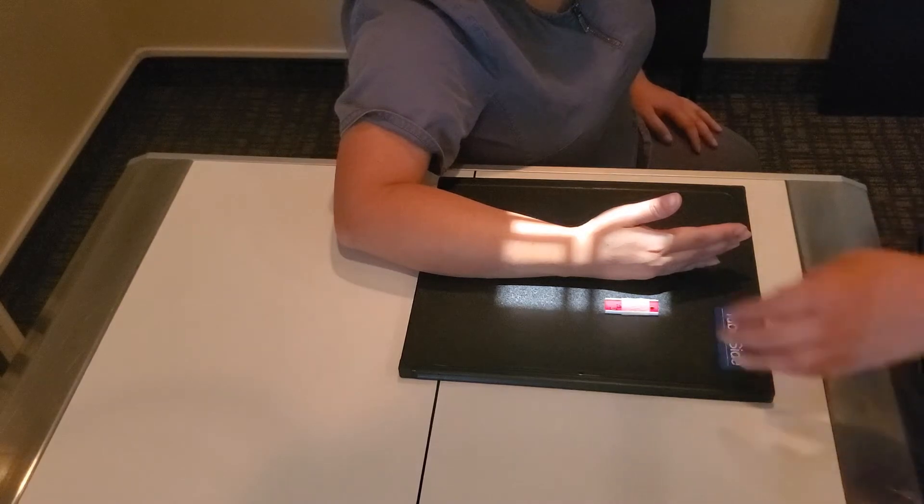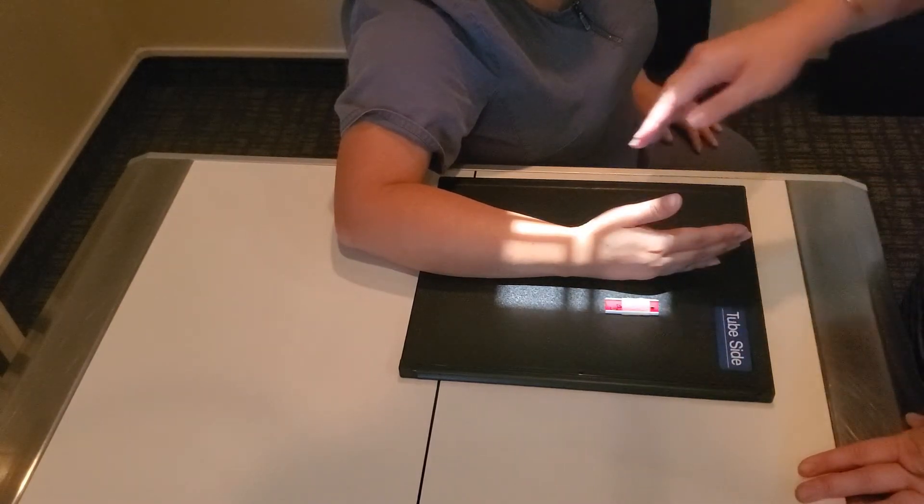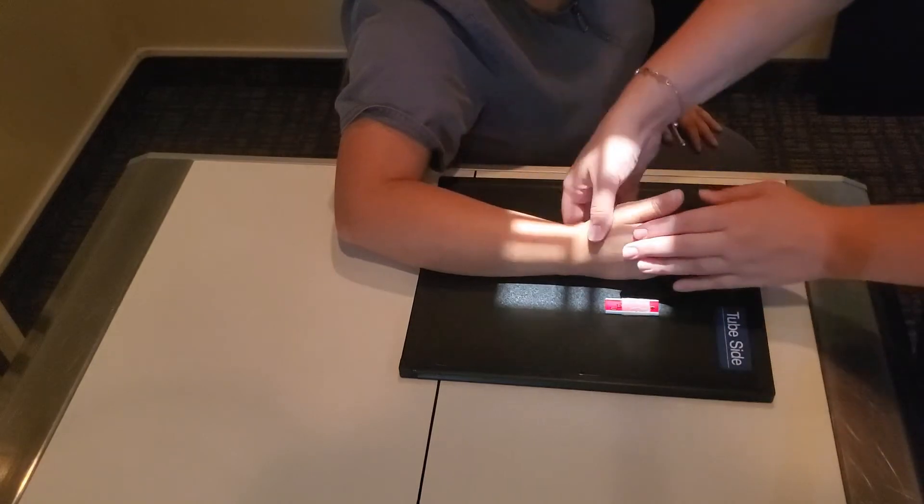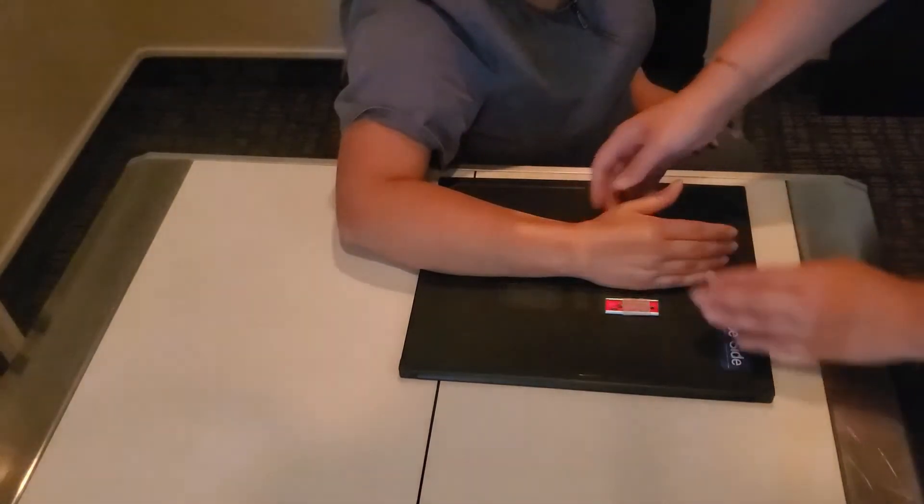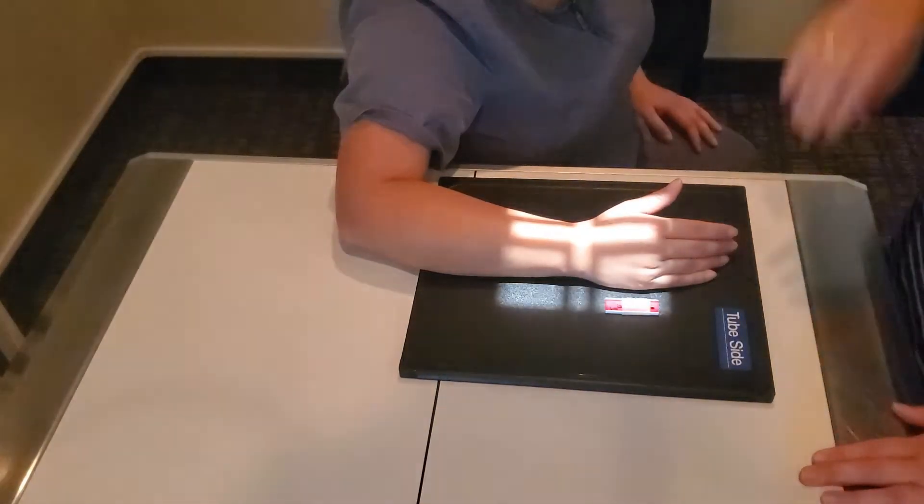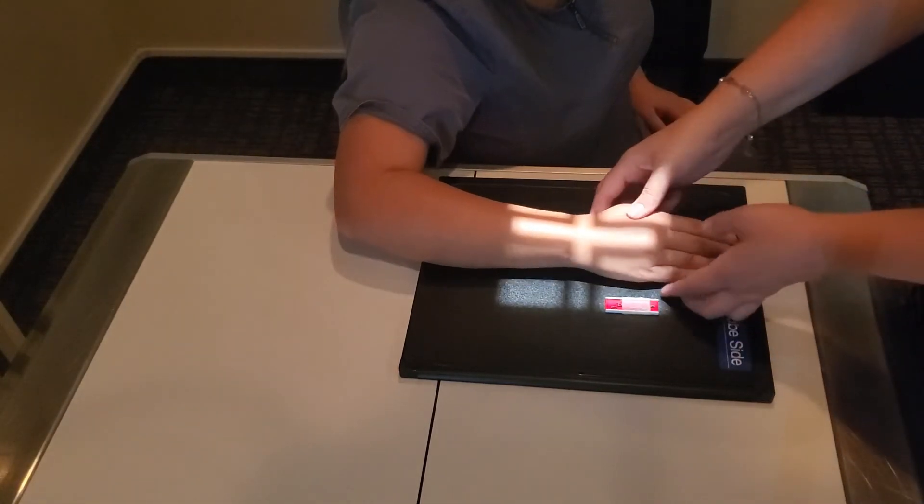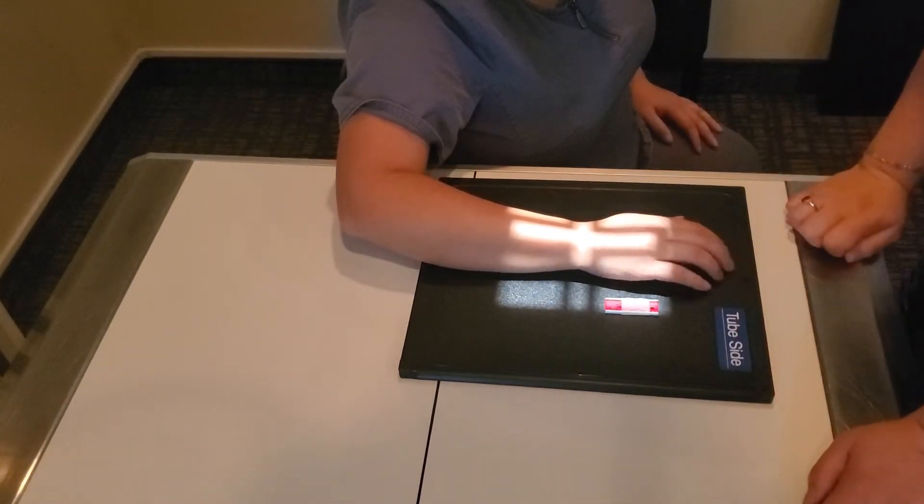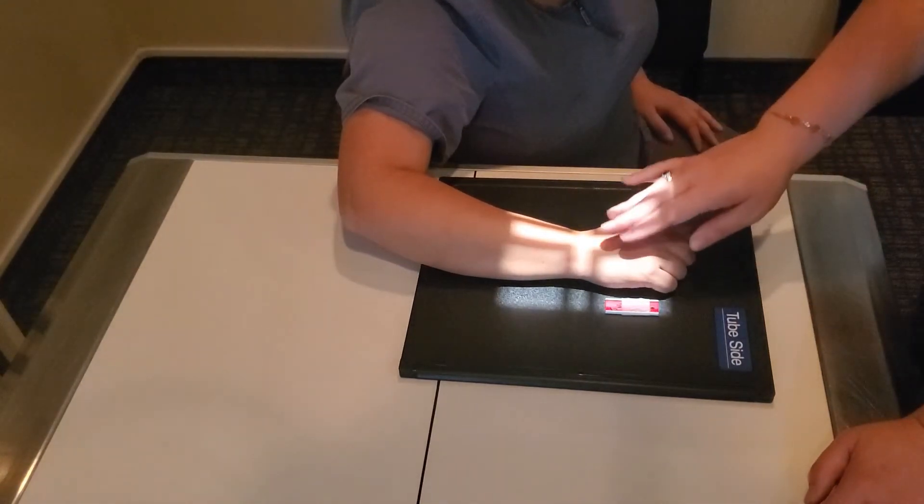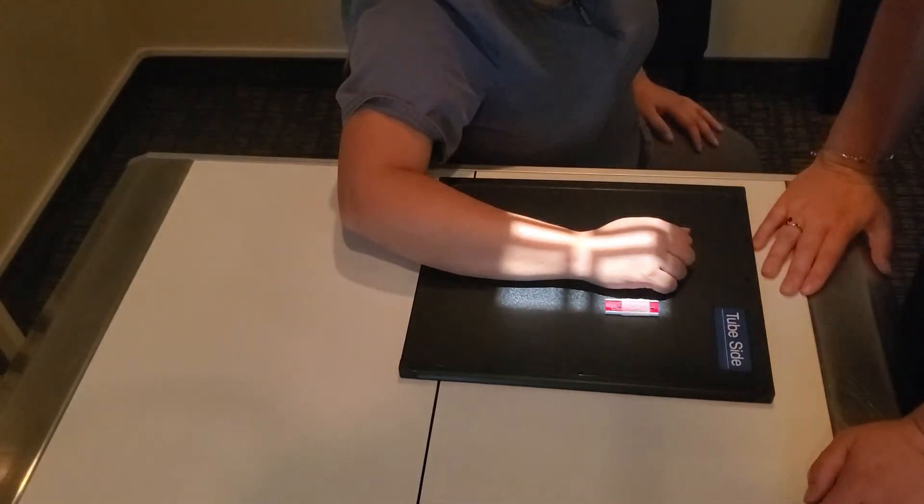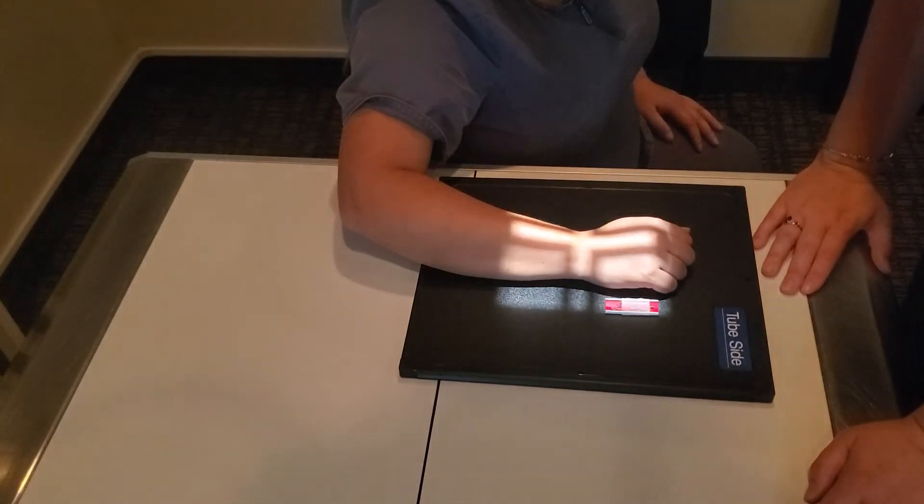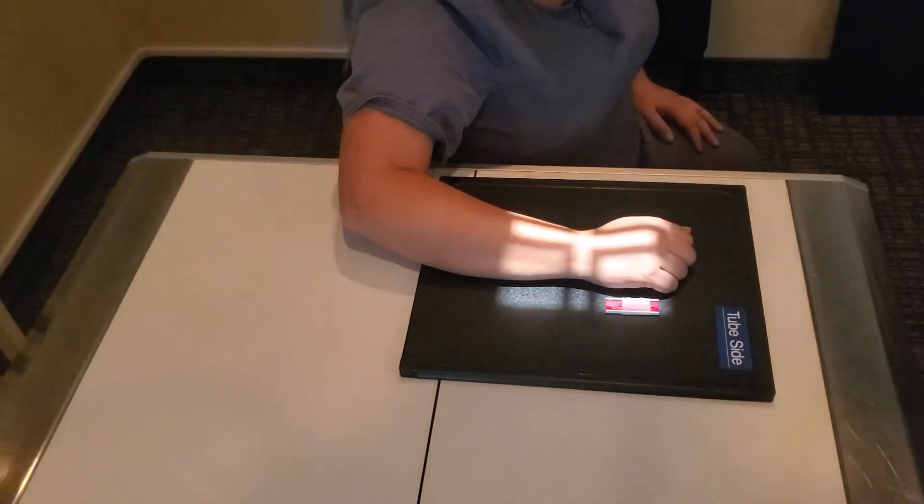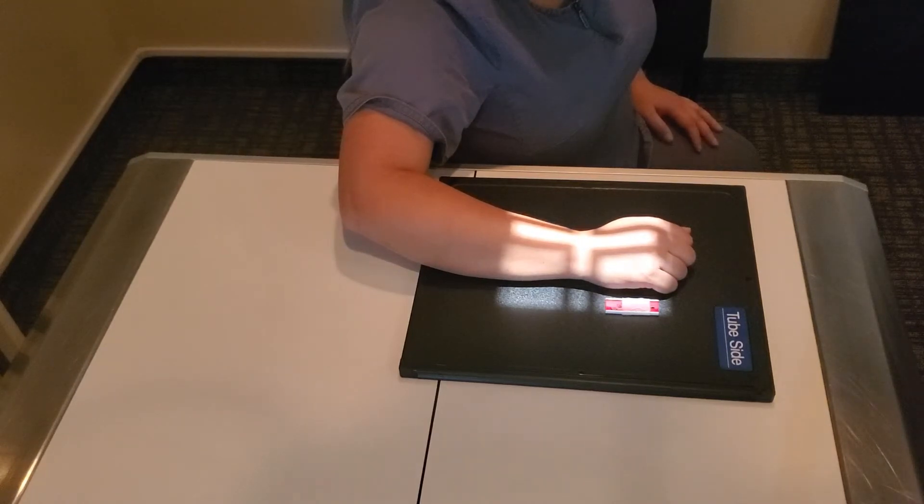So again 60 at 2 lateral position mid-carpal area rotating down to the 45, 57 at 2 still centered to that mid-carpal area and then your PA projection fingers curled underneath the metacarpals and centering to that mid-carpal area that is now at 54 at 2. So those are your basic ones and then we do a couple of images for the scaphoid.